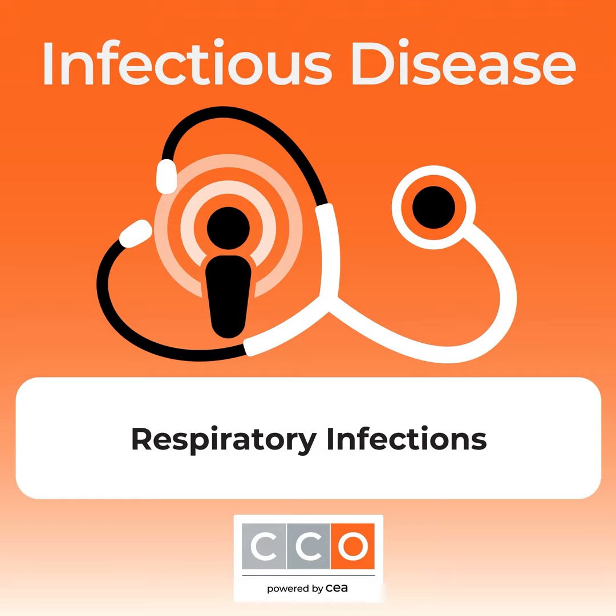So just some take-home points to wrap it up here about respiratory syndromic panels. They detect the DNA or RNA of many common, both community-acquired and hospital-associated bacteria, including atypicals, viruses, key antibiotic resistance genes. And then you get these results within a couple of hours, as opposed to culture results, which will come days later. Upper respiratory tract point of care panels can be used to improve patient satisfaction, but I think their influence on other outcomes is still mixed.